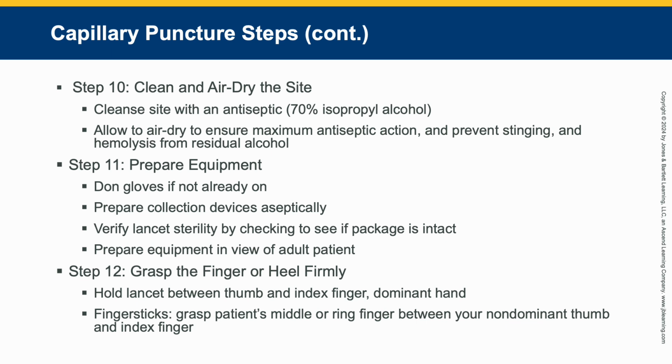And hemolysis. If you wipe them with an alcohol wipe and then immediately go to stick them and it's not dry, then this is going to cause hemolysis. It's going to lyse the red cells and cause hemolysis in your specimen from that alcohol.